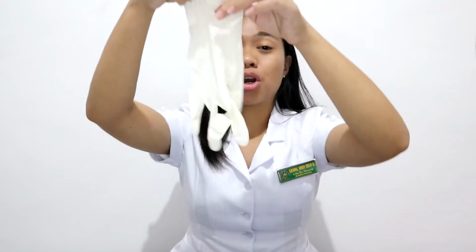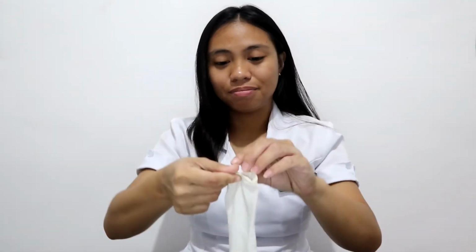Now, allow me to demonstrate for better understanding. I have here a bottle of mine that I will use as the forearm of the patient for this demonstration. First off, make sure your hands are clean by washing them properly and applying alcohol. Then, properly don your gloves.